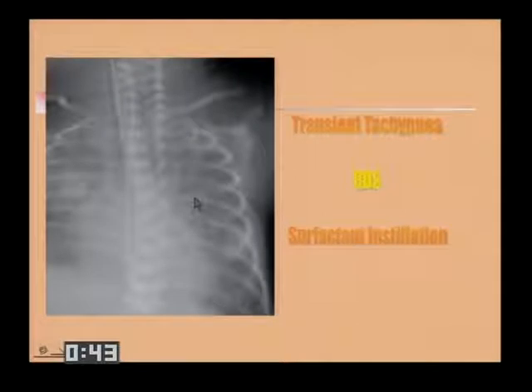One other thing that can cause a density in the lungs, which will clear rather rapidly in the immediate perinatal period, is that these babies are instilled with surfactant, artificial surfactant, and it goes in and it lowers the opening pressures of the small airways, so we see much less barotrauma than we used to. The children, rather than being on high volume ventilators, are on little oscillators, and it keeps the lungs well aerated.